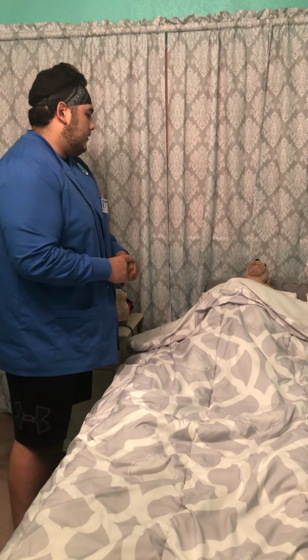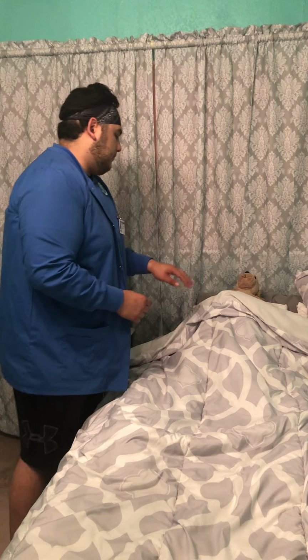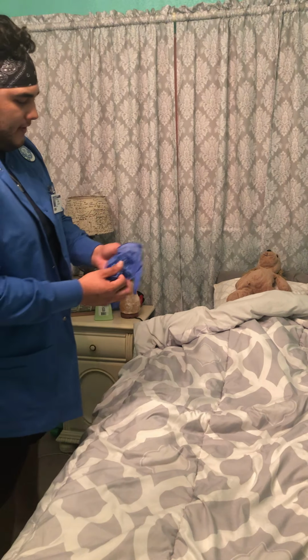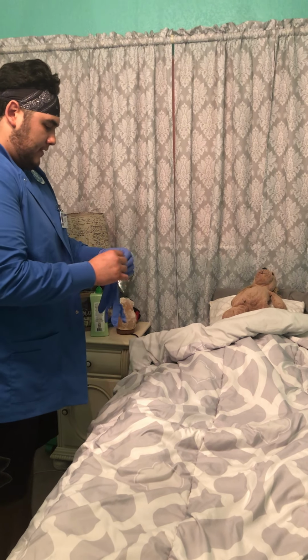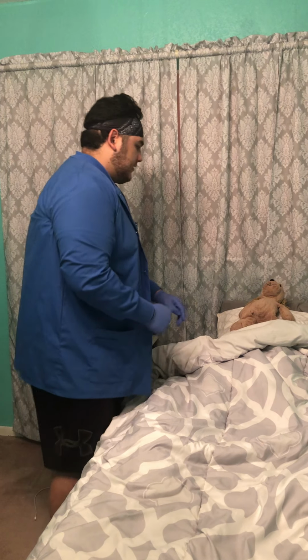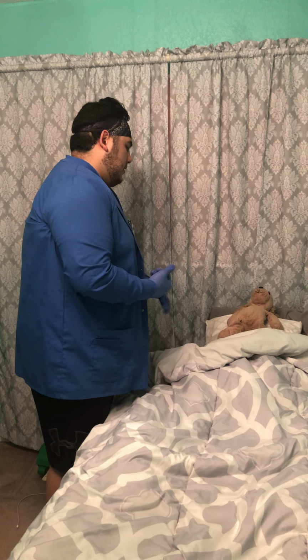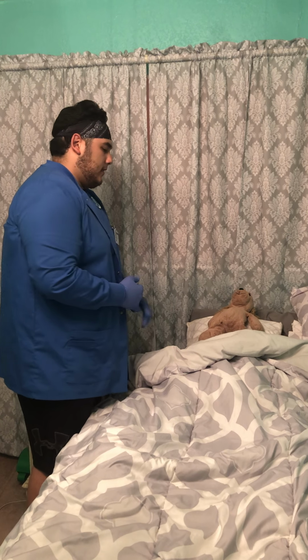So what we're gonna do today, we're gonna go ahead and insert a catheter into you, per the doctor. So I'm gonna go ahead and assess your bladder. So before you touch the patient, you always want to put on gloves. And so now we're going to go ahead and continue to assess the bladder. And so, alright ma'am, the reason for this catheter is you're having trouble voiding and your bladder is a little distended. So that's why the physician would like us to insert it.